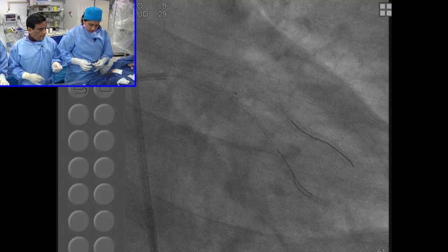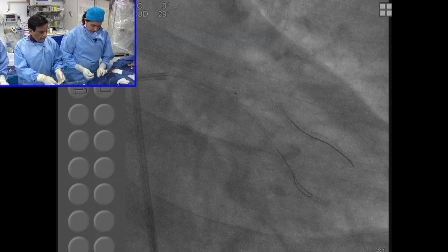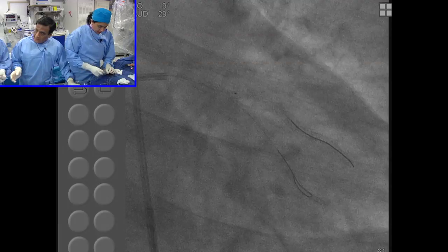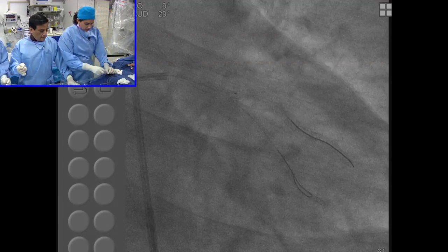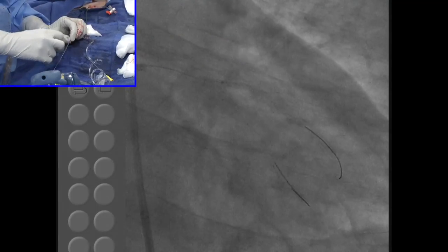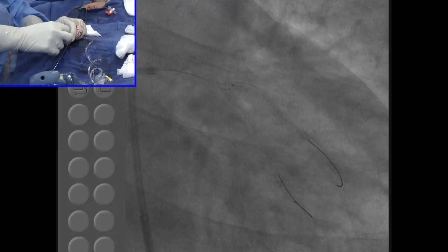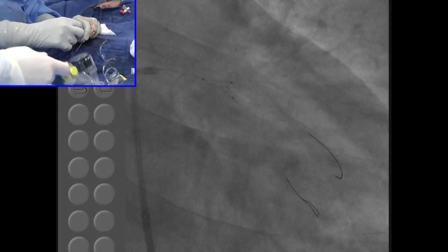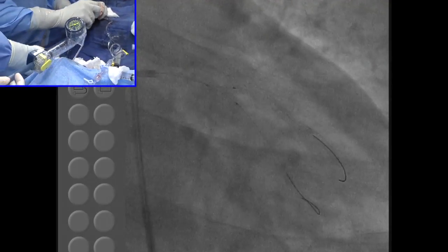Yeah. You have it, so it will be very good. Okay, now this is a 2.75 by 15 Quantum non-compliant going to the main. But this is again one-to-one. Good. So I can bring the Glider back.